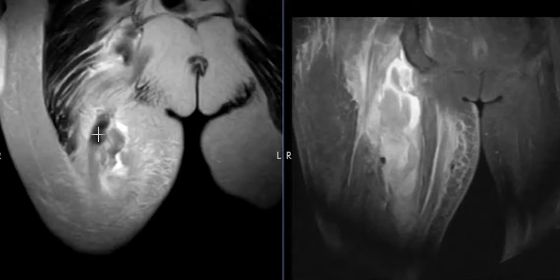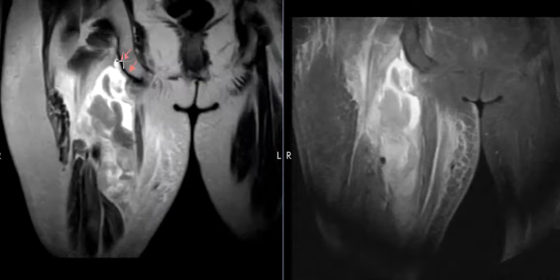The tendons kind of blend together, hard to tell apart. But we can see that this is the tendon that ends here. It does not go way up here to attach. And we're going to look on a side view in a second.